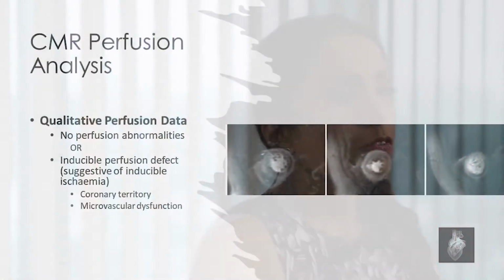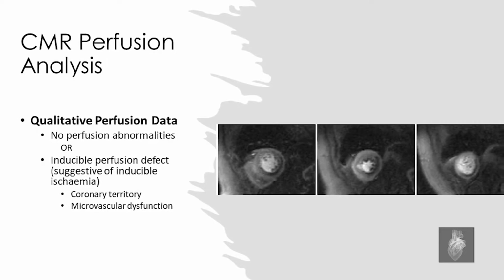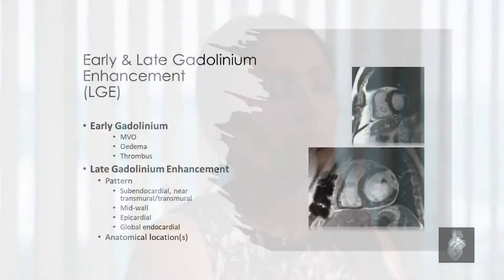In current routine clinical practice, perfusion CMR analysis primarily requires qualitative assessment regarding perfusion abnormalities. Fully automated quantitative techniques are becoming increasingly available. Contrast enhancement after gadolinium administration is a crucial aspect of clinical CMR.